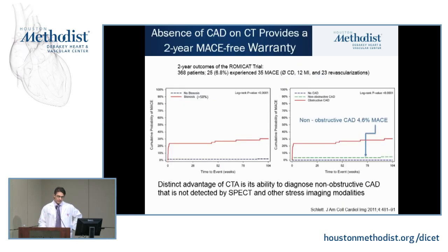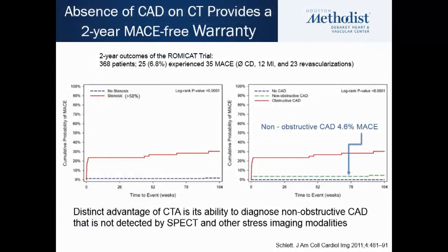All right, so then of course the other issue is, what does a normal CT mean? This is one paper, again in the ED setting, showing you the value of a normal CTA here in the blue dashed lines. You can see if you have a normal CTA, you can be very, very confident that your patient is not going to have an event when you send them home from the emergency department. Obviously, if the study is abnormal, these patients have a greater likelihood of MACE.